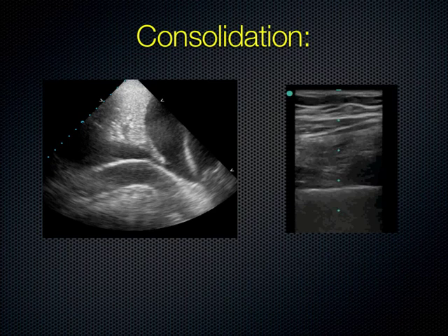through the lung, you can appreciate in that, even just in the 2 centimeters of lung you can see in the high frequency probe, it looks gray. It doesn't look black. And that's a consolidation. Again, normal lung, A lines, you don't really see the lung itself. You see the artifact as opposed to pneumonia, where you can see the lung, the bronchi.